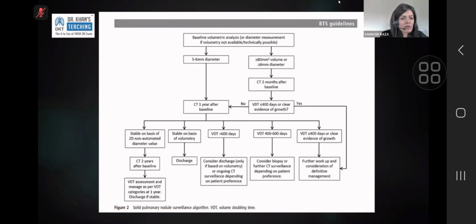What is the nodule size lowest limit to pick up on PET CT? Are you saying what is the size that the PET CT would be the most helpful on? It depends on your PET CT reporters. Some PET CT reporters won't give you a definitive diagnosis from less than 8 millimeter. Some will give 5 millimeter, but for the purpose of a radiologist, a thoracic radiologist, a general radiologist, I would say 5 millimeter is the minimum soft tissue you need. For example, if it's a part cystic nodule, part ground glass nodule, the solid bit you want is at least 5 millimeter to give PET a reasonable chance.